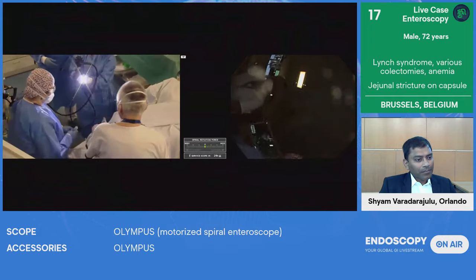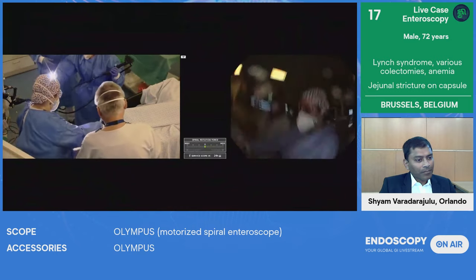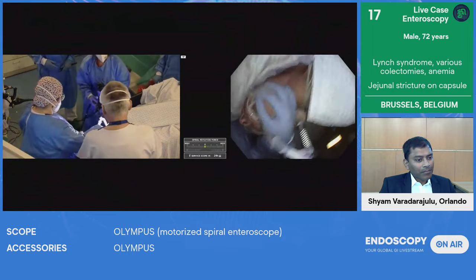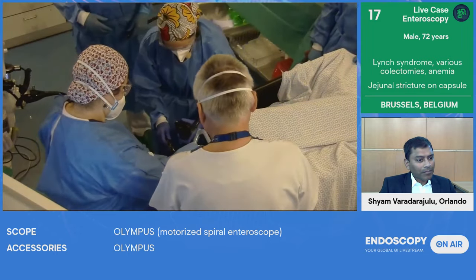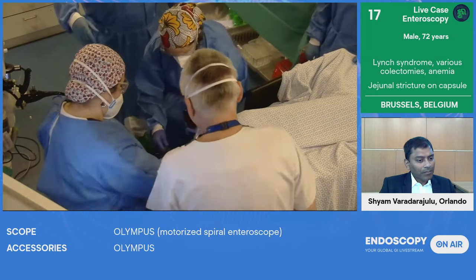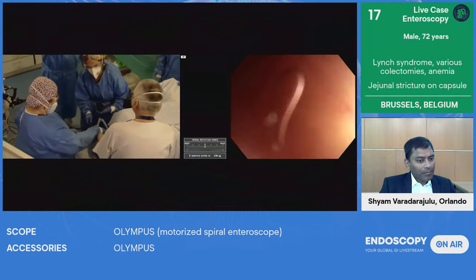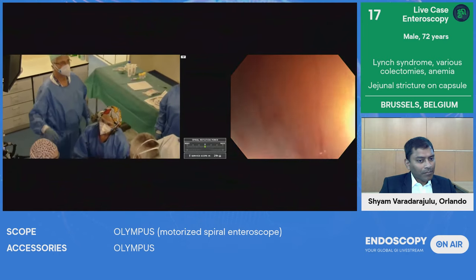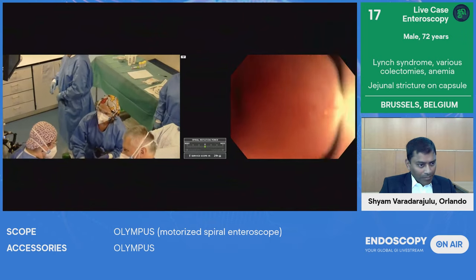So we introduce the scope. It's very important that we put the patient in the left lateral position. We still do it with anesthesia and tracheal intubation, but in Düsseldorf again, they have been doing it as well without intubation, so it's possible. And what we will do here, we will insert the tip of the endoscope, like a normal endoscope.